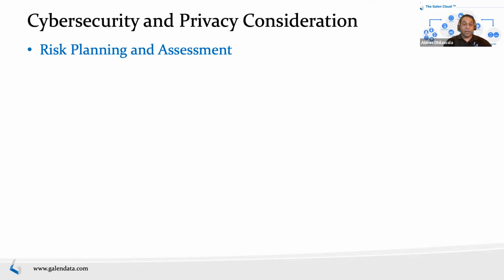You do risk assessment of your cybersecurity, and just like any other risk, it has to be in the entire lifecycle. So as you update functions, as new information comes through, you go and replan and reassess those risks. Part of the risk assessment is to identify all the data you're going to cover and which of that data is protected. Not all data is protected, but a lot of the data is protected.